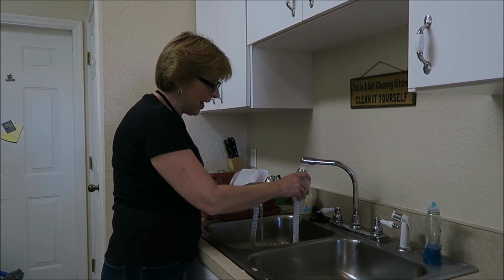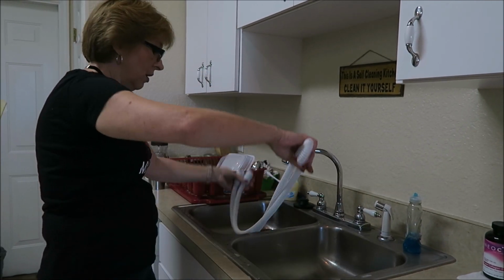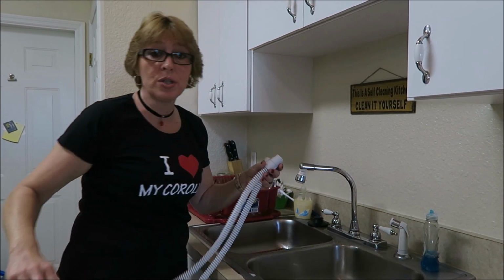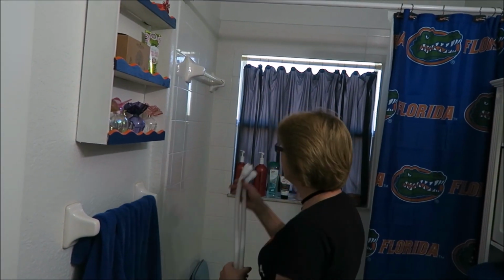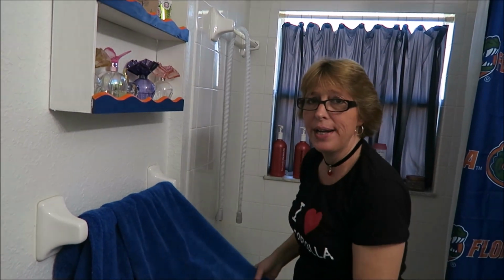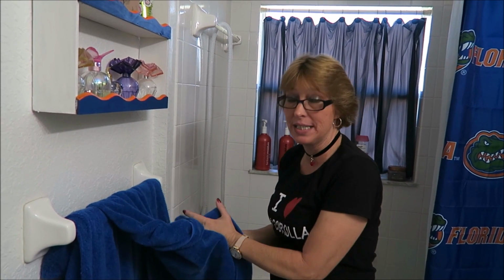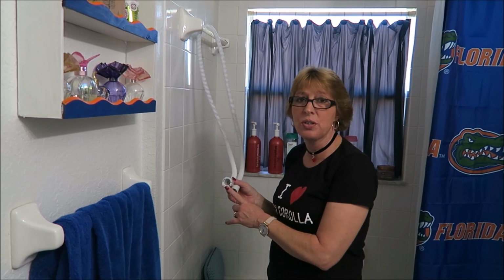As you see, I'm trying really hard not to get my connectors too saturated, because that's what helps control the humidity and moisture in your CPAP machine. Then all you have to do is take this and hang it over my shower, drape it over, and let it sit there and drip dry until about an hour before I go to bed. About 9 o'clock, I'll hook it back up, get everything ready, and put fresh distilled water in my machine. You still have some condensation in here, but you want to make sure these connectors are dry. Don't want to plug them in and get the shock of your life.